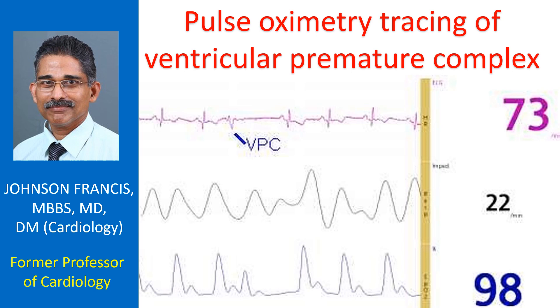All other QRS complexes are narrow and have preceding P waves indicating that they are sinus beats in regular sinus rhythm.